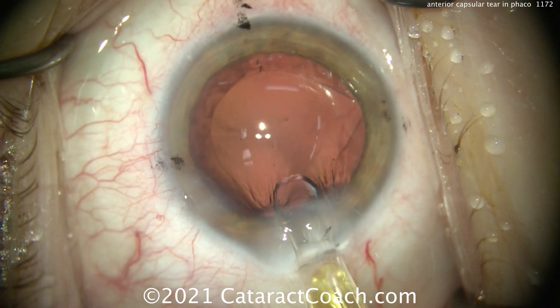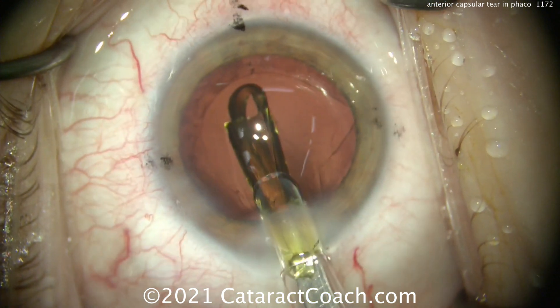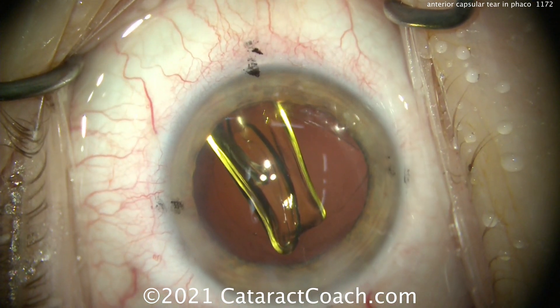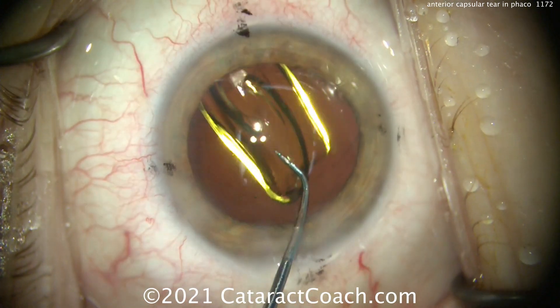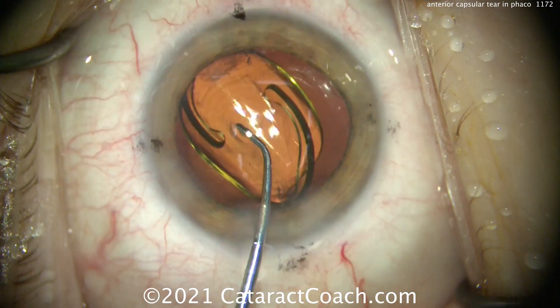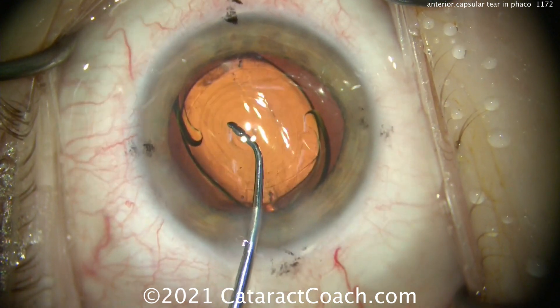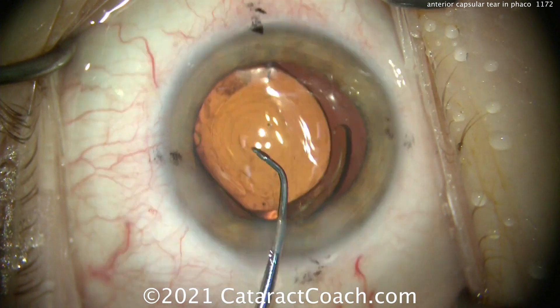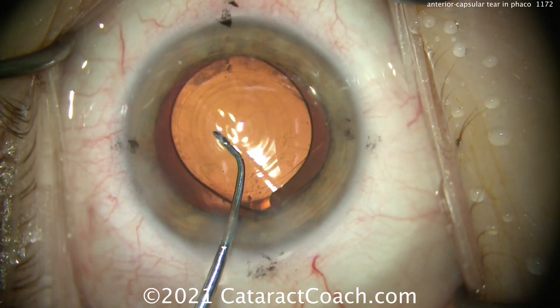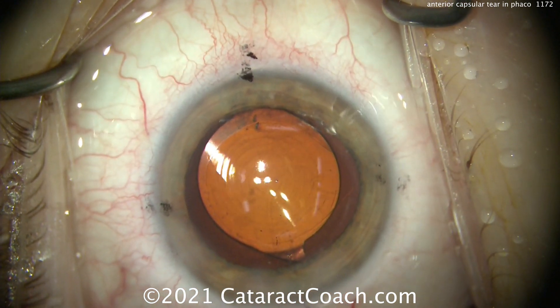Here's how we're going to continue — we've got to put the lens in. We want to get this lens in an appropriate position without having to do a lot of rotation within the bag, because a lot of rotation within the bag may cause that tear to rip out more. So we're going to slowly put the lens in, let it unfold, get it in the bag. Notice the orientation marks on the optic, which are right at the haptic-optic junction. I place those about one clock hour before I want it, and now I can slowly dial it exactly where I want it to be. I'm trying not to have too much manipulation within the bag — I don't want to have to keep rotating the lens.